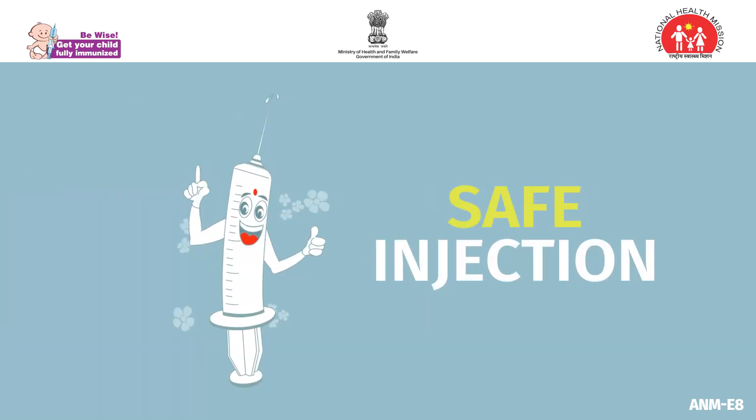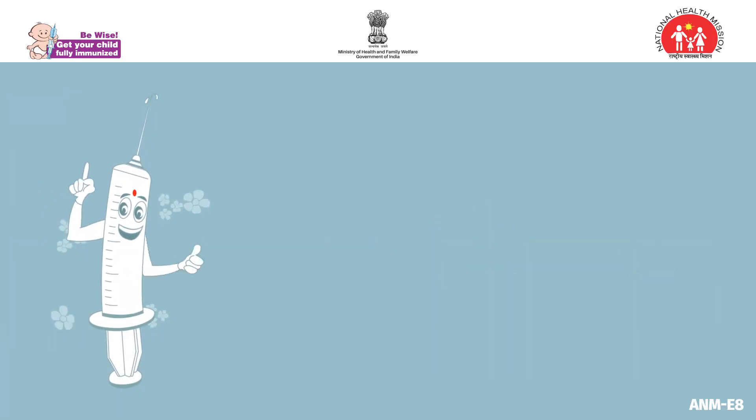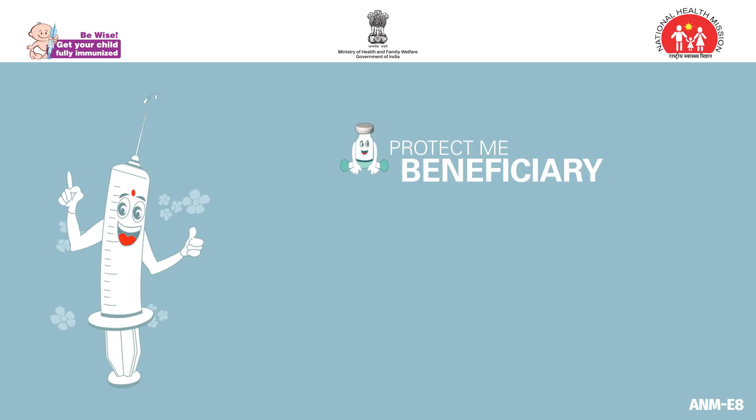Safe injection procedures protect both the beneficiaries and healthcare workers. Follow these steps to ensure safety each and every time.